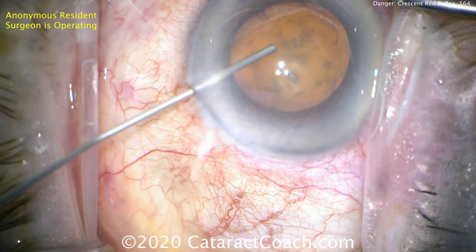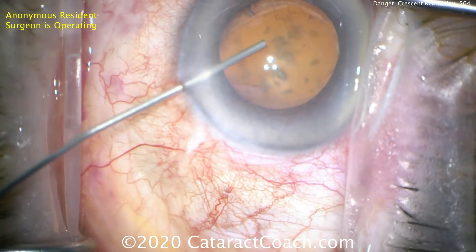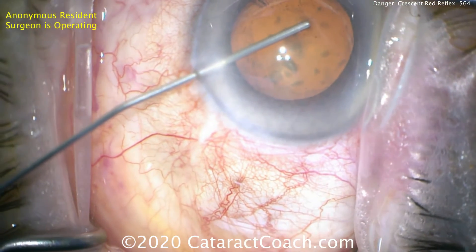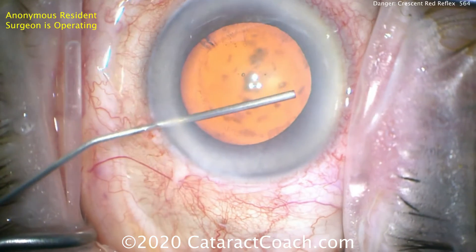Severe pseudoexfoliation. Notice how much the anterior chamber deepens — two millimeters in the pre-op period at the slit lamp, but here with viscoelastic, that's four millimeters. That means the zonular support is very weak.